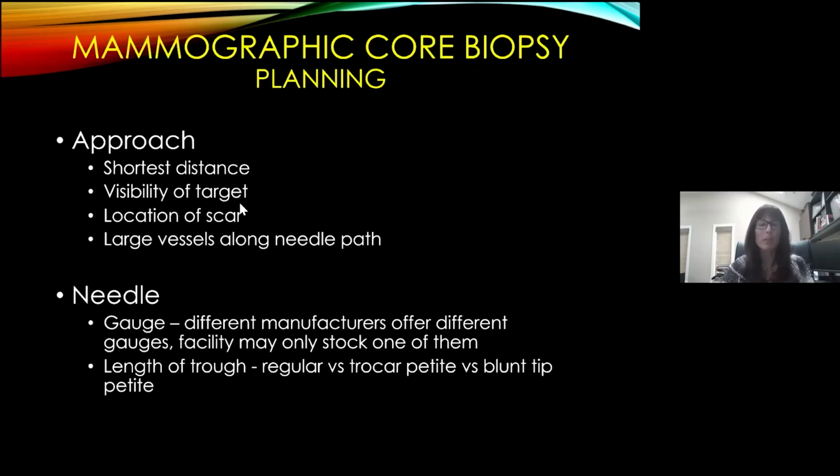One reason could be visibility of the target. Sometimes calcifications are better seen on one view than another, and even though they may be a long distance, you may want to come from a different direction. Also, I consider where the needle entry site and subsequent scar would be, and I try to avoid producing a scar on the medial or superior breast if I have a choice.